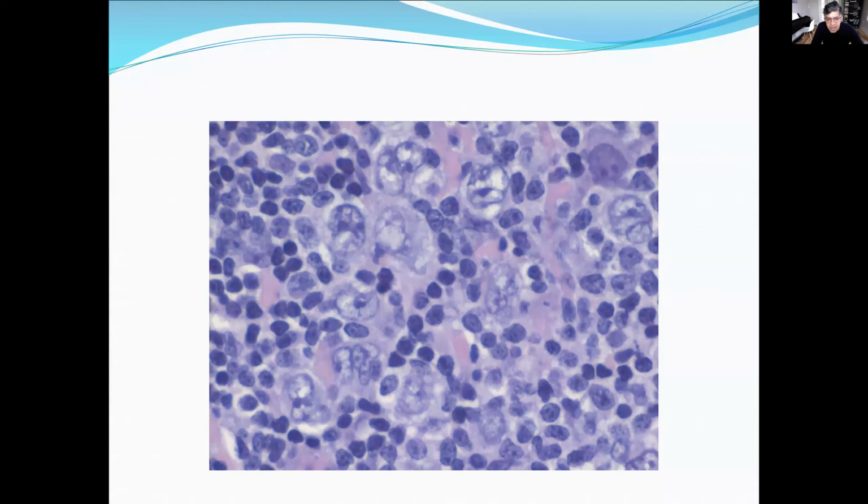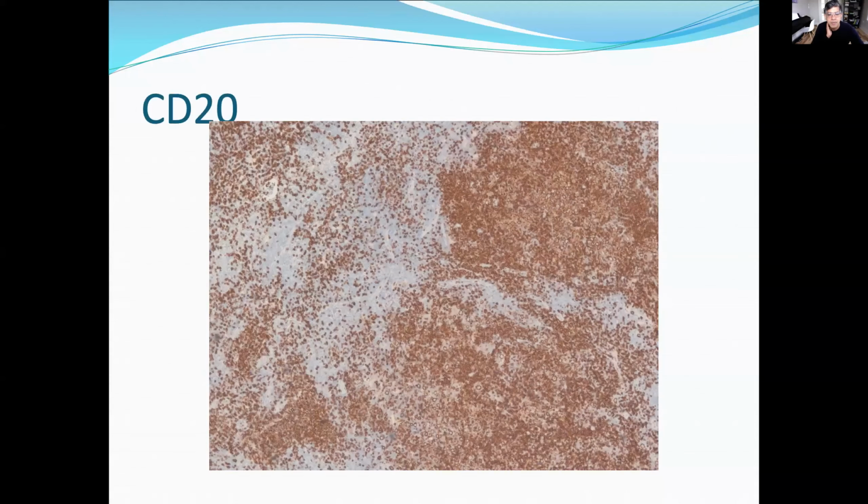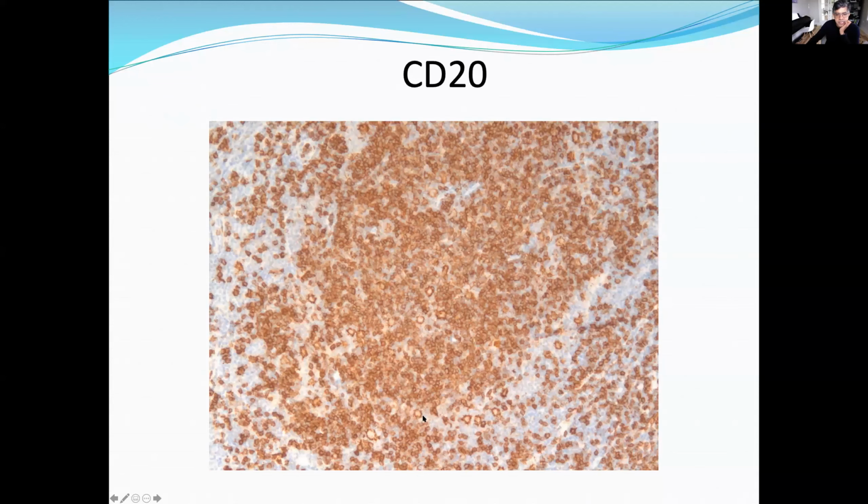And this is like 100x or something. I never take 100x in lymphoma, but this is one of the rare photos. This is CD20 showing nodules of what look like small B cells with large B cells sitting inside the nodules, something that Dr. Dekanha was alluding to earlier, why this wouldn't fit the definition of the entities. And this is another nodule with large cells. You have to pay attention, and then you see the large cells there.